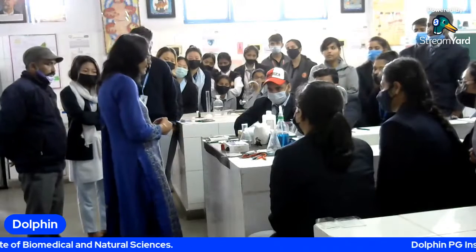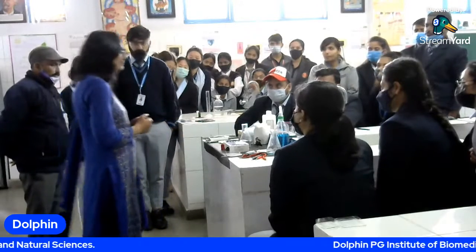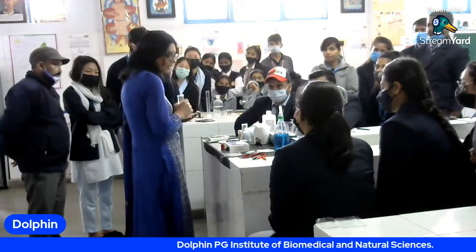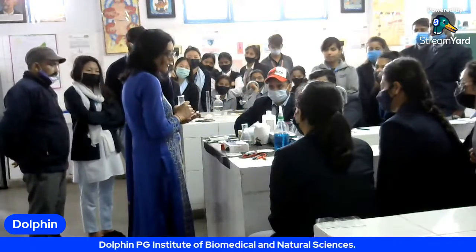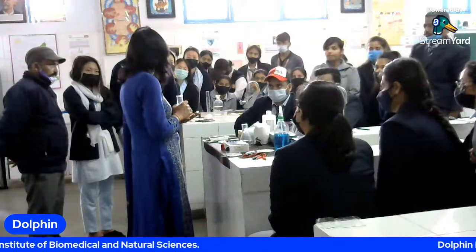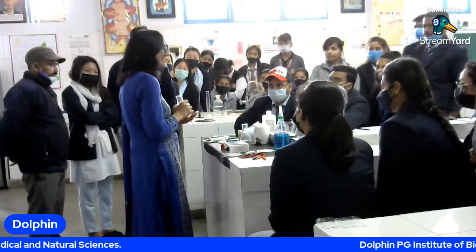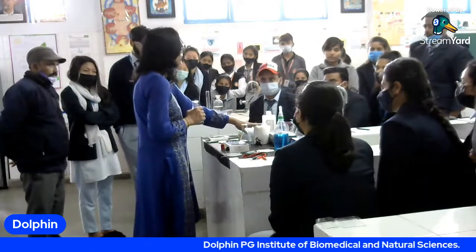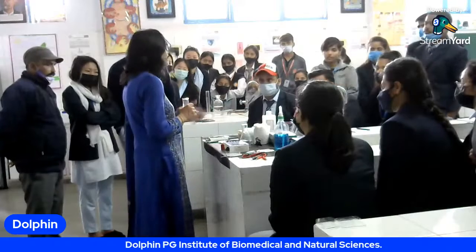Okay. So first of all, what we can do, we can pour this agarose on the glass plates, and one of you can prepare the moist chamber. Take the cotton, soak it in the water, and prepare the moisture.